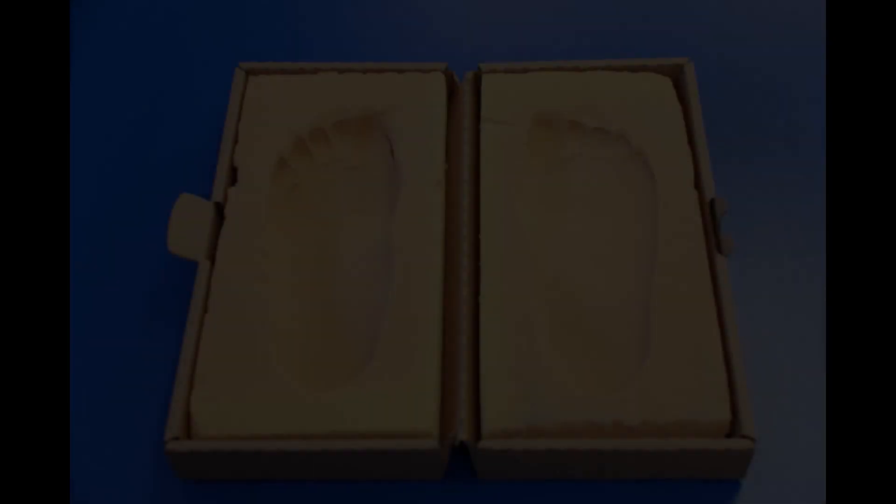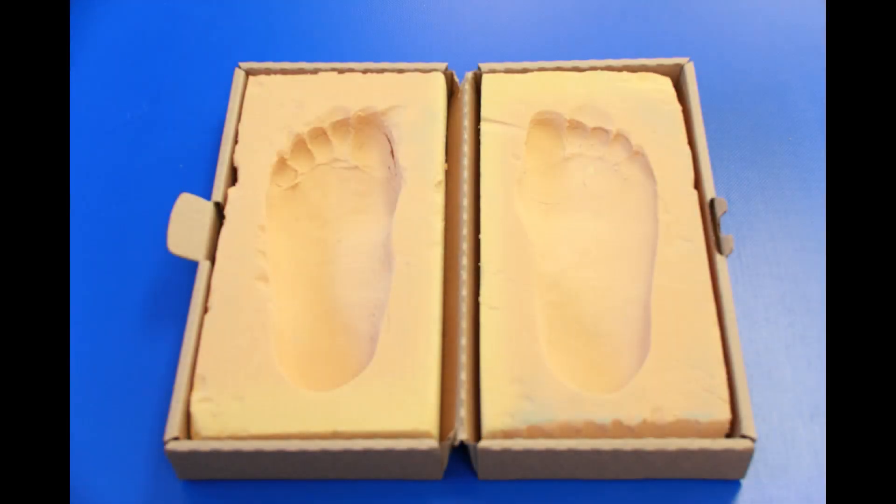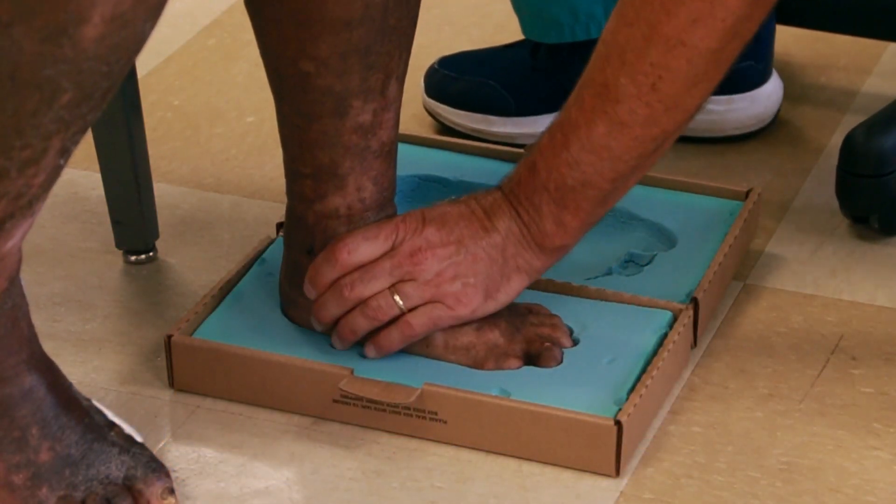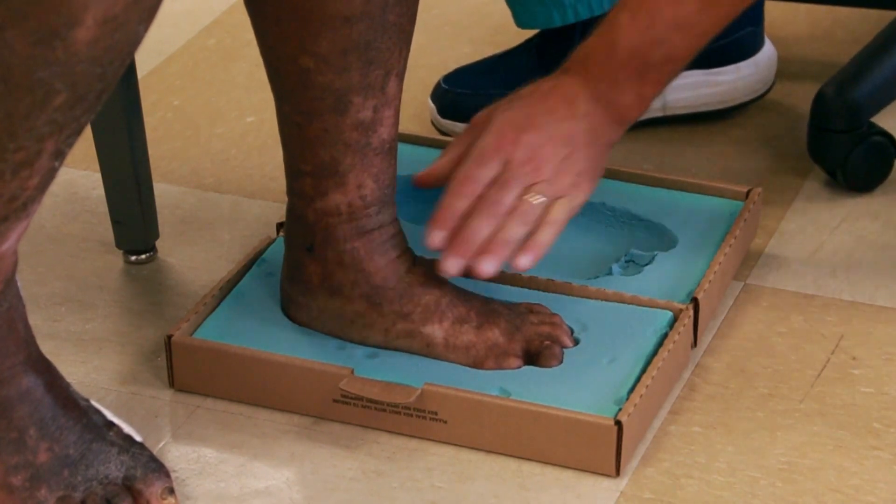The following short video demonstrates the proper technique to take impressions of the feet using the Amfit foam box. In order to obtain an accurate mold, the foam impression must be deep enough to capture all of the curves and contours of the patient's foot. The goal is to press firmly so that the foot will penetrate the full depth of the foam box, especially at the heel and the forefoot.